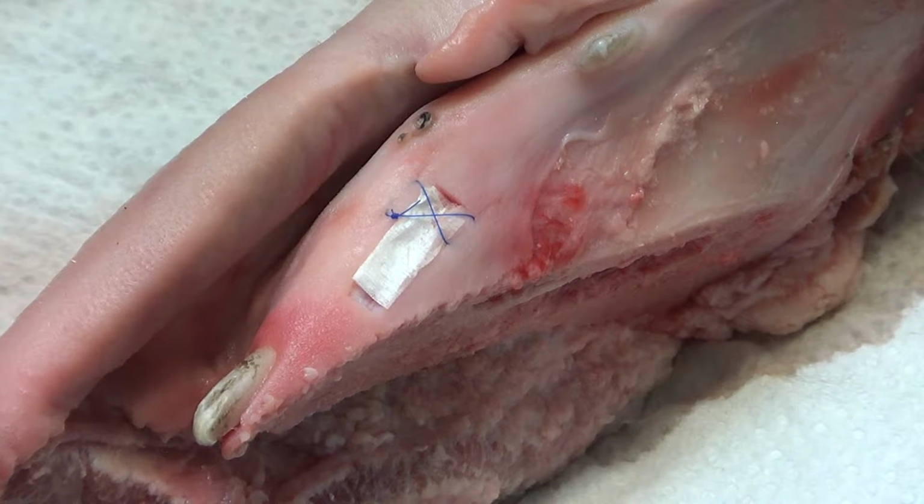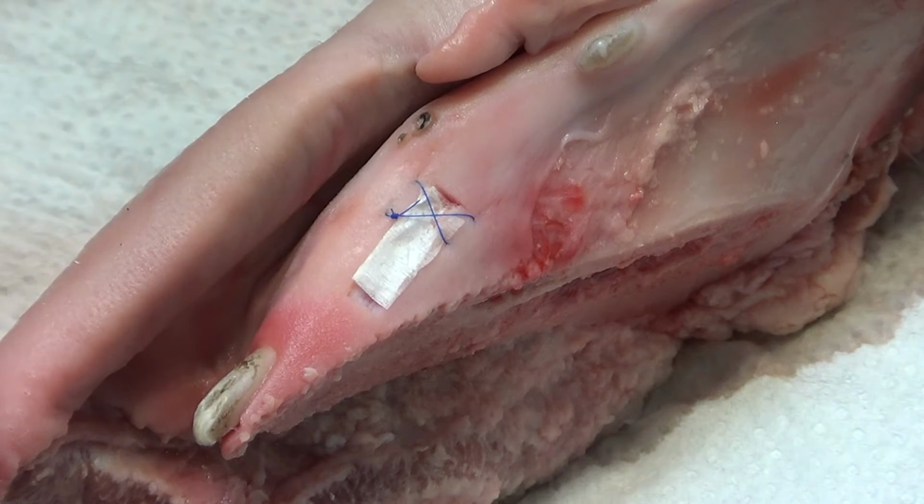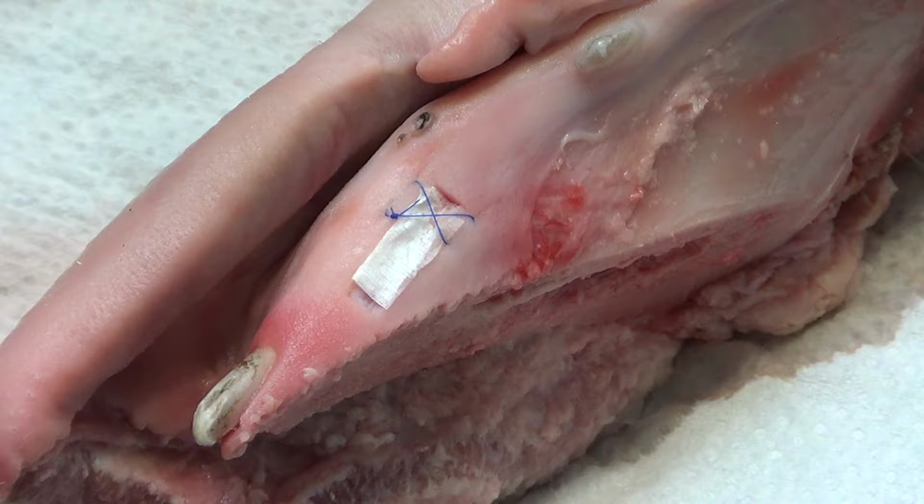Don't put it away because, Ilona, when you have done the suture, we can start the vestibuloplasty.